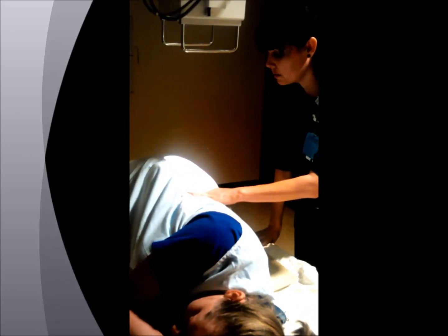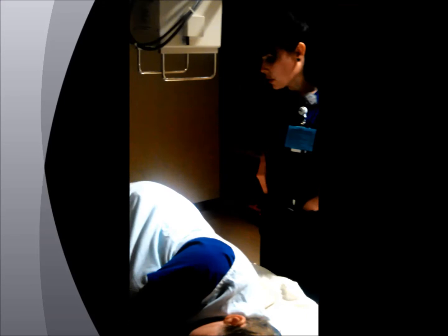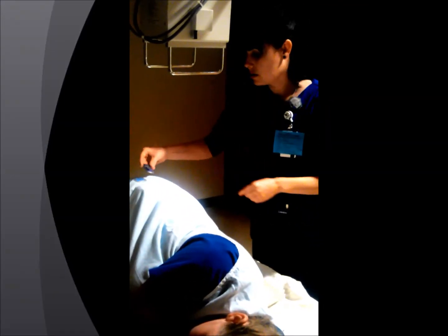So let's make sure that she's lined up. Ma'am, I'm going to feel your hip so that we can get you lined up. Okay, so we're going 1.5 inches below the crest and then about 2 inches posterior to the ASIS. And we're going to collimate down because we just need that L5 and then we want all the way to the sacrum. We're going to put our left marker on there because she's in a left lateral position.